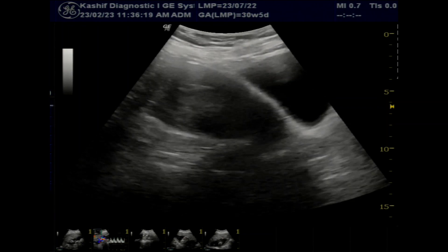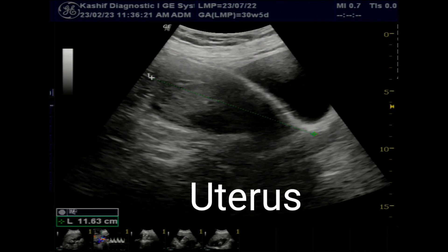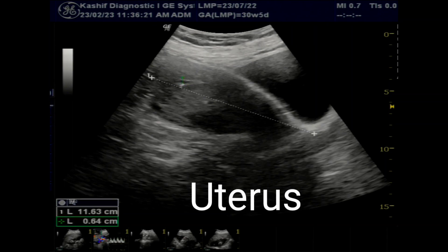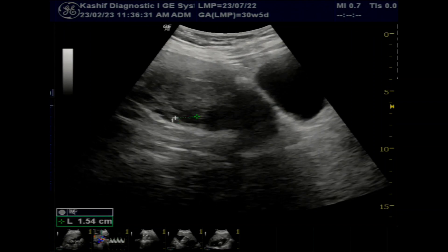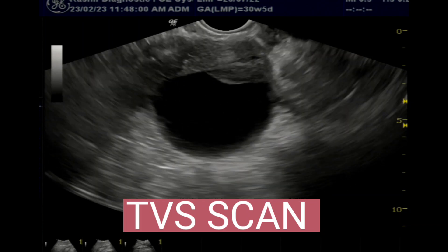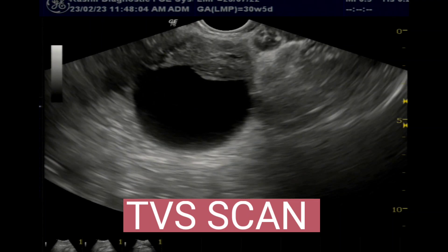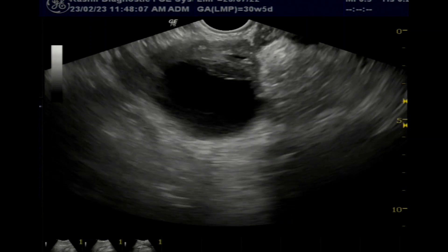There is no free fluid in the pelvis. Posteriorly placed cysts are more difficult to visualize on abdominal scan, so a TVS scan of the patient is done. The TVS scan shows a more clear view of the cyst. The cyst is thin-walled and filled with clear fluid.